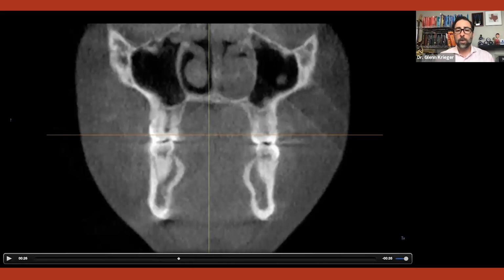Look at the width of the lower versus the width of the upper, right? Look where the teeth are, right? I want you to look at the nasal floor, right? Look at the turbinates and look at his ability to breathe. Now, mom has never had a problem. How old did I say? I think he's 14 or 15 years old, almost.